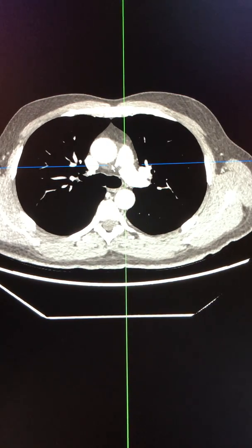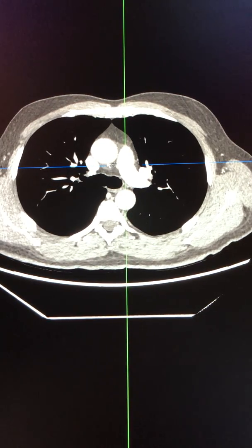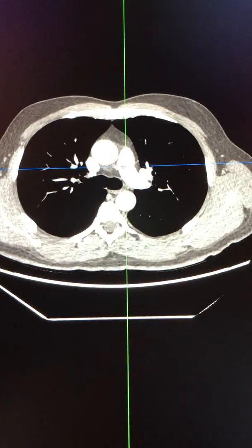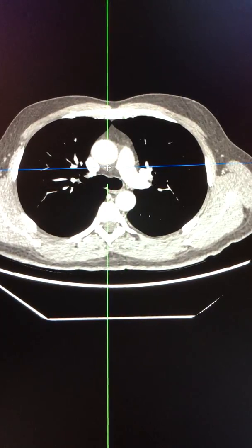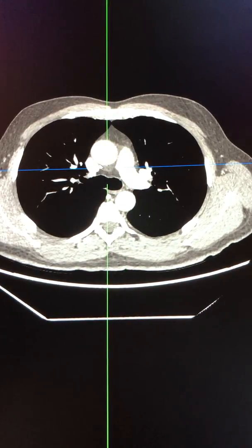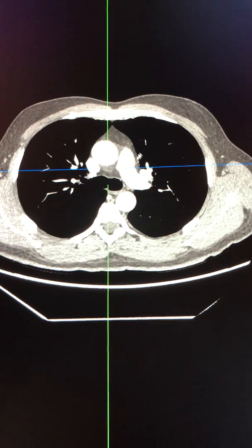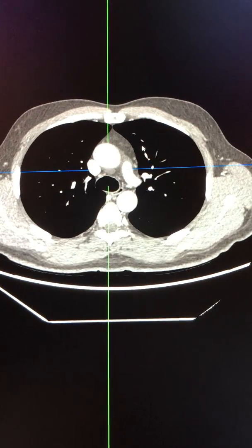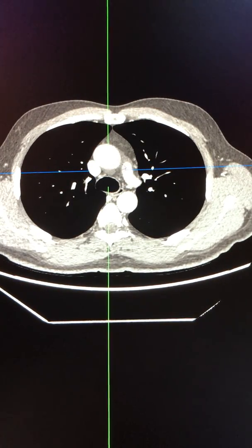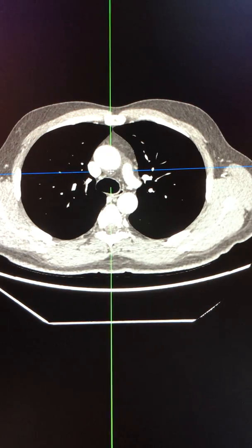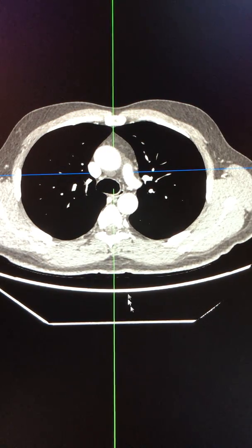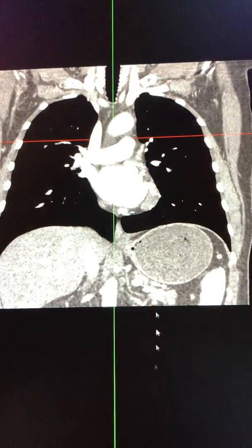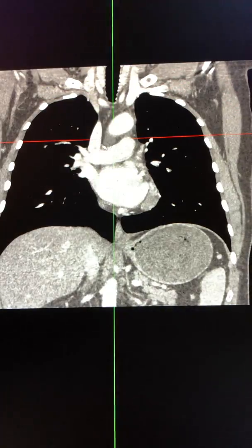In this case we can see a crescentic collection of pericardial fluid at the posterior aspect of the ascending aorta, which extends around towards the left lateral aspect. This also occupies part of the aortic pulmonary groove.